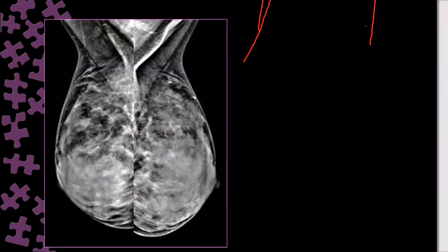And what about this one? Quickly, one of you tell me. Too high. The level of the pectoralis is not at the level of the nipples. The pectoralis is not well seen. The border is not well seen. The height is not optimum. The shape, nothing is optimum regarding the pectoralis. Very deficient, inadequate pectoralis on both sides.